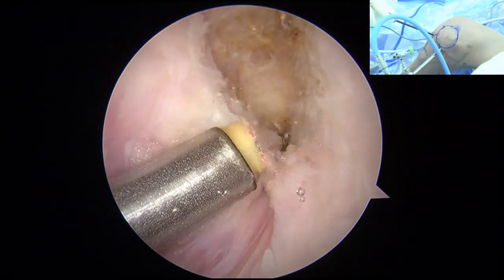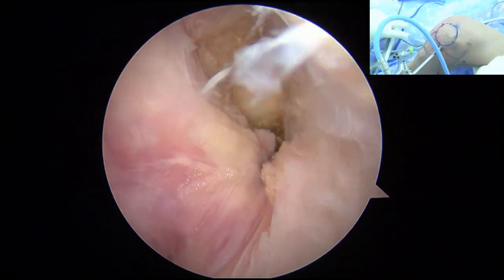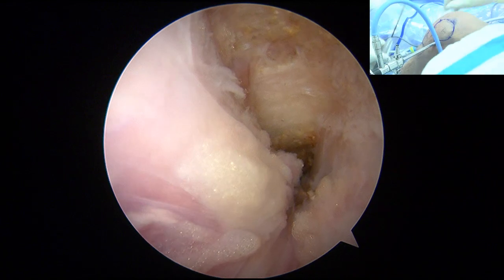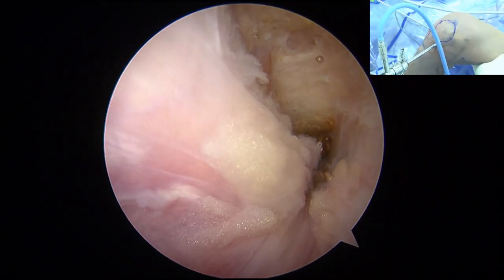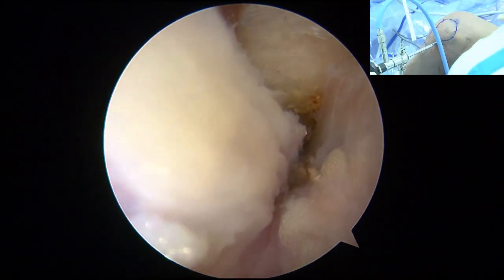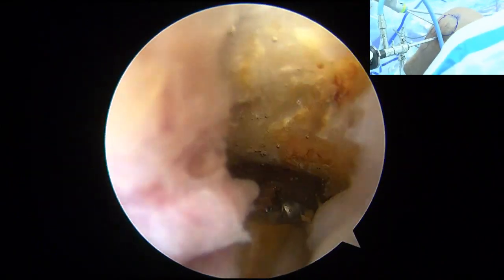Good. And your left hand side, your left is PCL, right is ACL. Okay. We call this the intercondylar approach. Then give me the shaver. 然后这个通道就在两个交叉韧带之间穿进去。Give me switching stick, 所以是交叉韧带间入路。Switching stick. 交换棒。Okay. Good. So now next step is to follow this, okay?